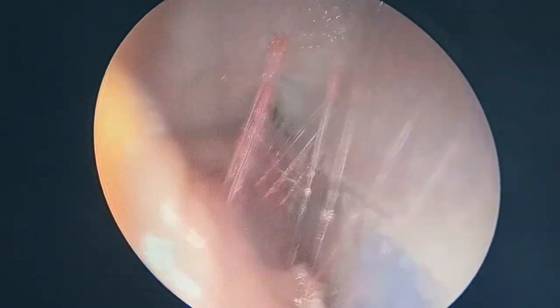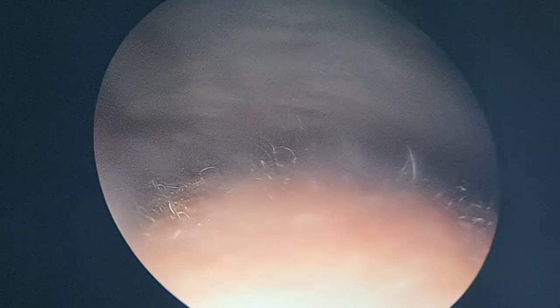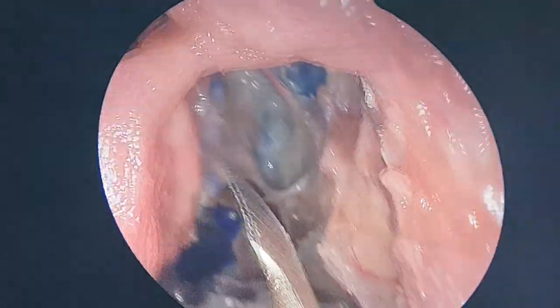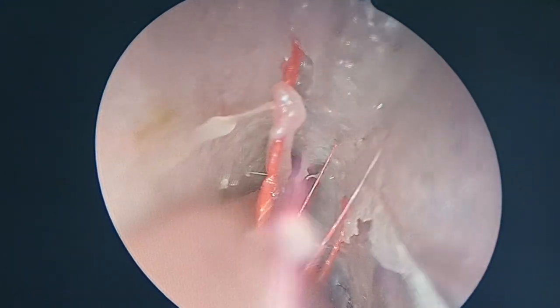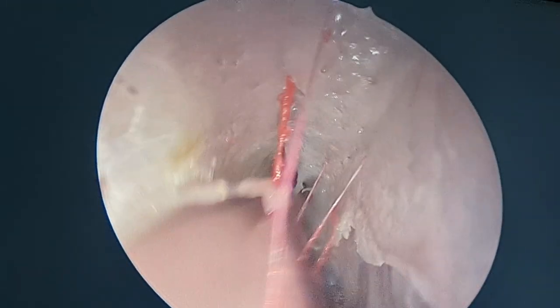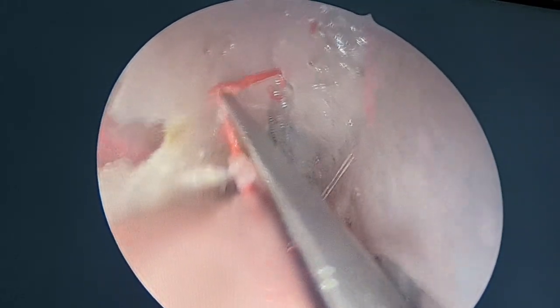First, you will see one or two branches of the anterior ethmoid. Sickle, do you have? See this? These are the branches of the anterior ethmoid. You come across. So this is the anterior ethmoid branch. Here. See this? Not sure that you can coagulate it. Yeah, you can coagulate it easily. This is where it is being done.